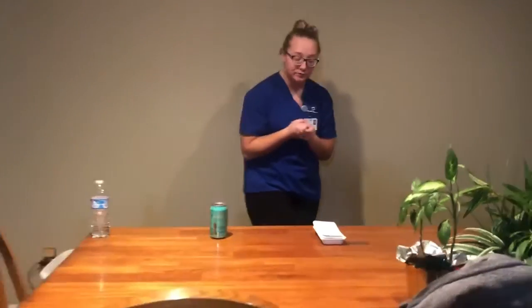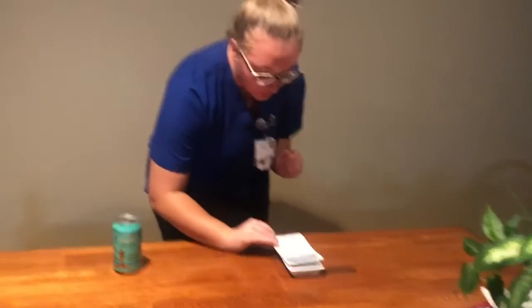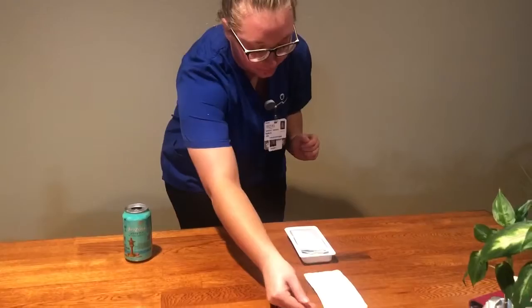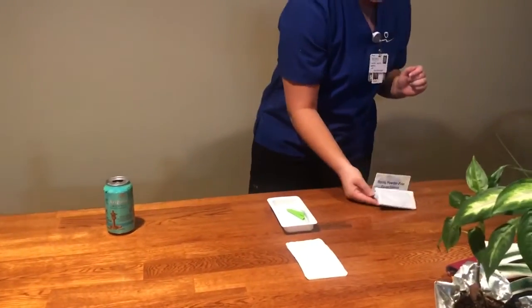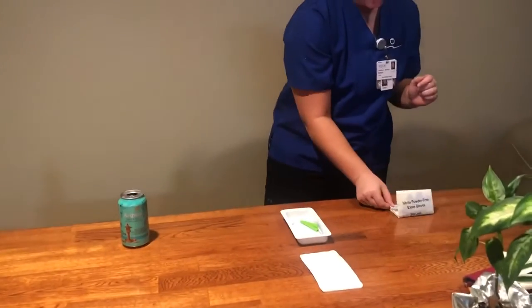After that, I would apply PPE because it's not already applied. So I would apply PPE. Then after that, I'm going to open my sterile kit. And then using my 1-inch border, I grab my gloves and stick them to the side.